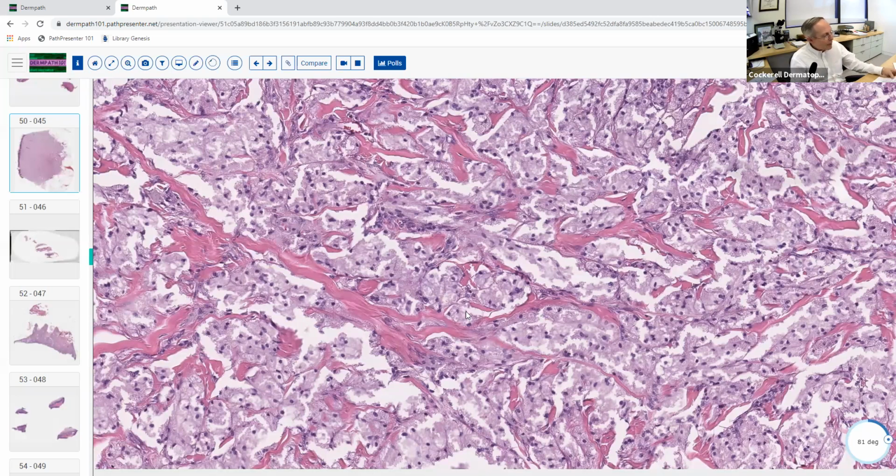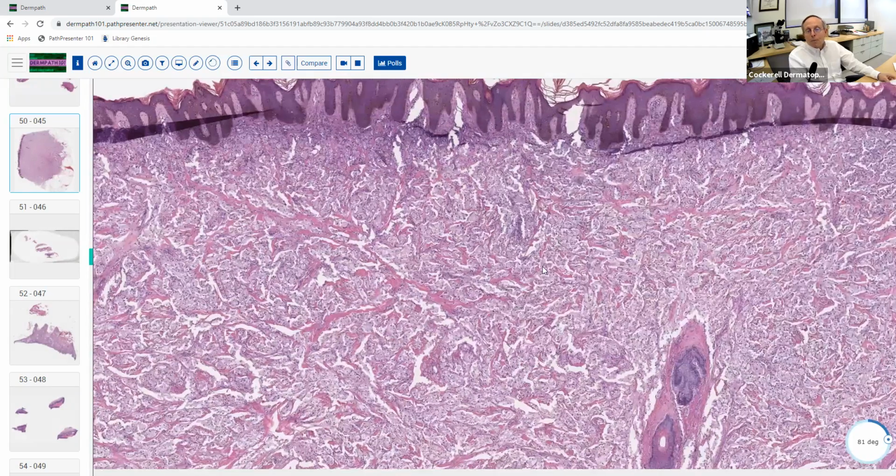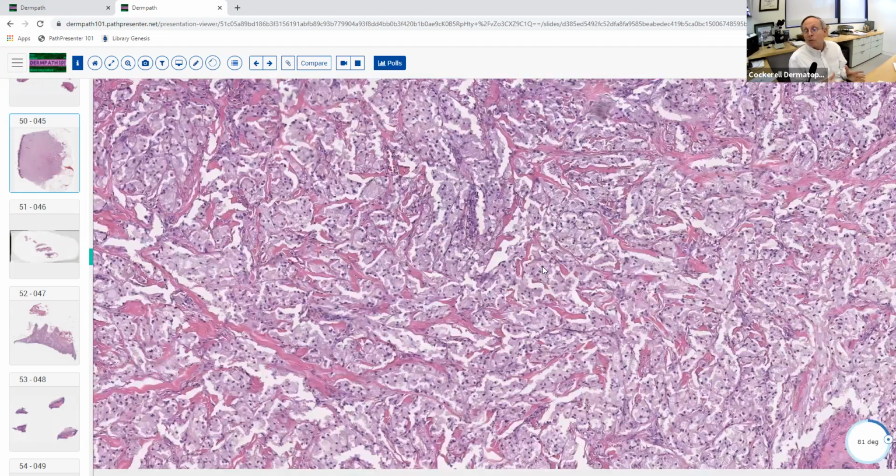And this is a 42-year-old woman with a lesion on her arm, but this is an interesting lesion that commonly occurs on the tongue of African-American patients. So if you get a picture of a bump on somebody's tongue, they stick their tongue out, it looks like there's a bump there, and they show you maybe a histopathology picture that looks like this, well, you'll know immediately the answer is granular cell tumor.